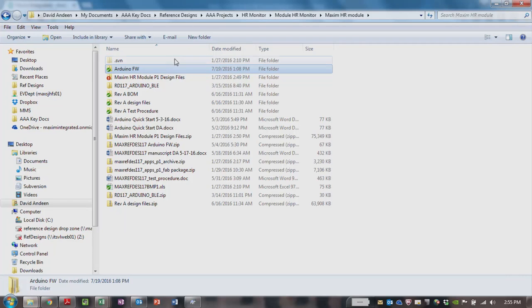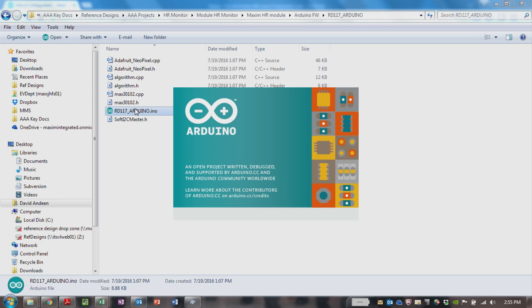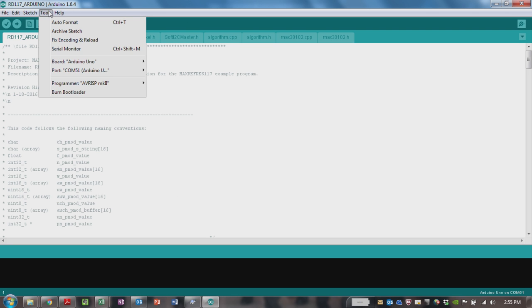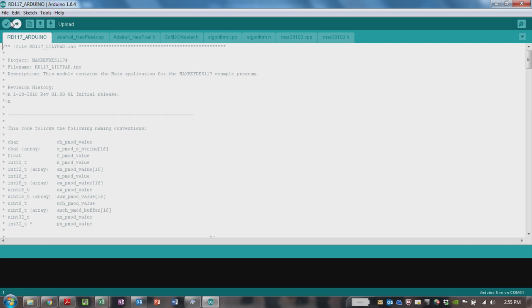On my computer, I've got the firmware already pulled up, so we will see it on the screen here. I'm just going to double click on that INO file, and it'll bring up our Arduino development environment. Let's go ahead and maximize that. Let me make sure that I'm on the right board. I'm on Arduino Uno, and I've got my COM port selected. So Gordon, I'm going to go ahead and compile this code.